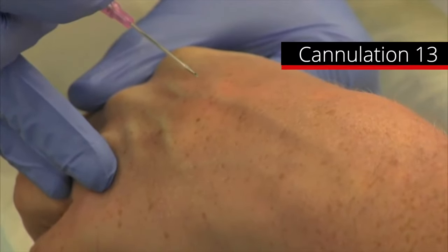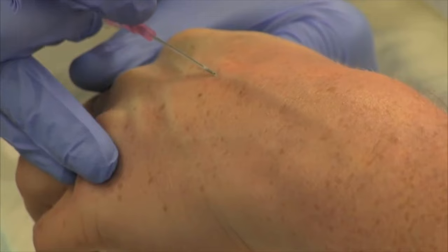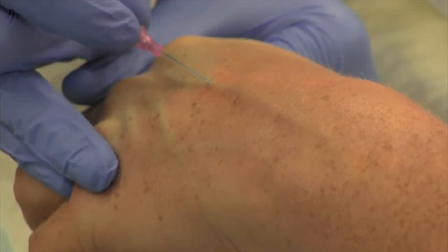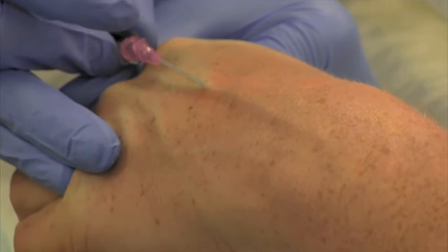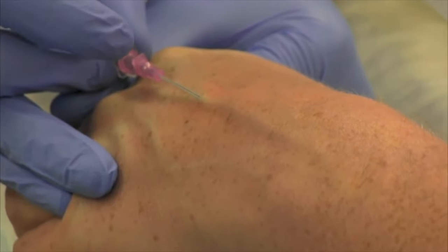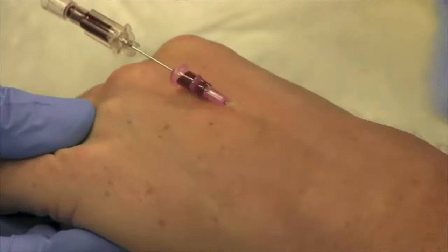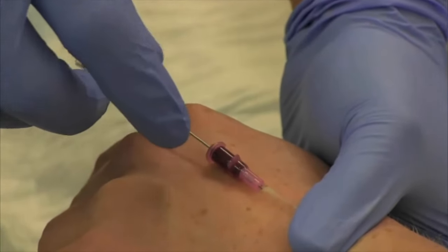This is the footage from my very first cannulation video on my mate Julian back in 2012. Here I'm showing all the aspects of anchoring my hand using my ring and little finger, getting the right grip on the cannula, going at a low angle, and tensing the skin with my left hand with my thumb over the edge of the knuckle so it doesn't impede my angulation. When you start out, it's completely okay to go slowly — you've got to make sure your technique is really correct. As you get more experienced you can go faster, especially with easy cannulations. With difficult cannulas I still go slowly because you need time for that flashback to occur. I thread with my pointer finger and you can see that blood rushing back, which confirms it's in the vein.